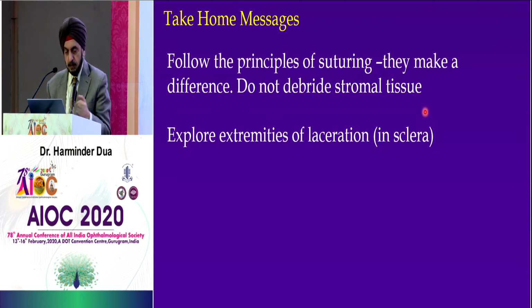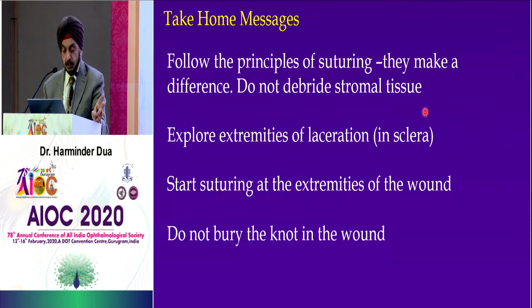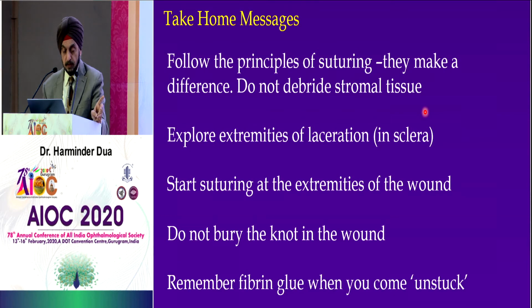So that's important. Explore the extremities in the sclera, very important. Start suturing at the extremities and move centrally. Do not bury the knot in the wound. And remember, glue if you come unstuck.